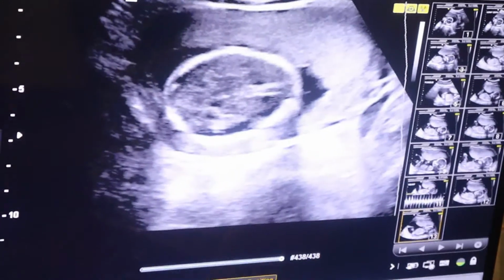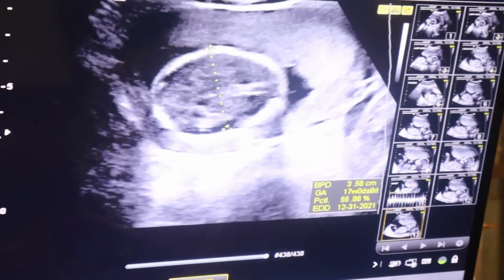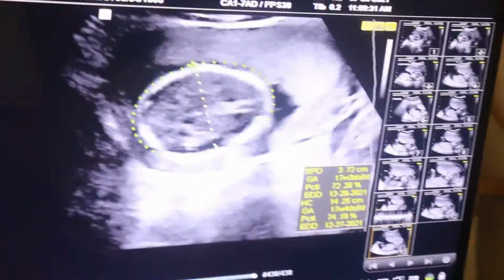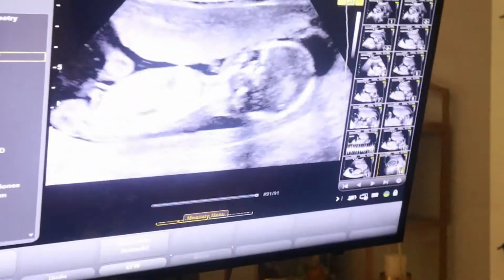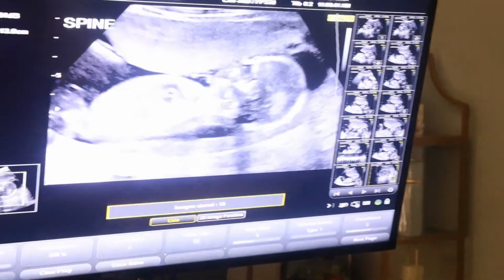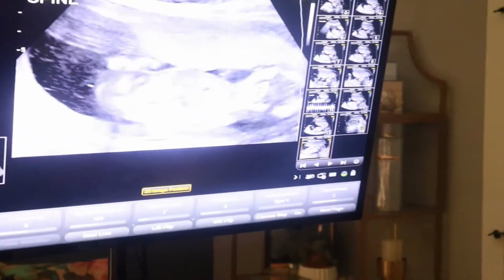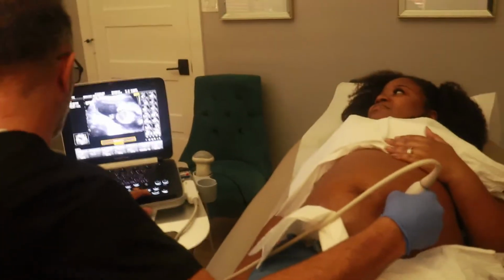Do some measuring. That's the top of the head, width, and circumference of the head, spine, back of the neck. This just looks so weird, showing all those little vertebrae, making sure we don't see any widening or separation of any of the vertebrae. That's all the stuff we're looking for.